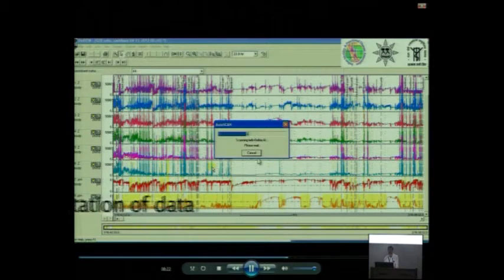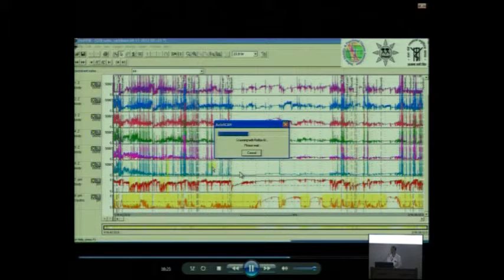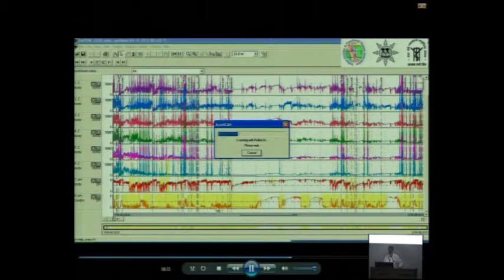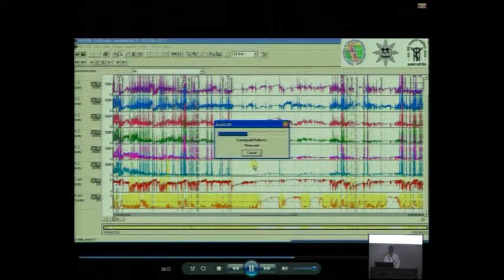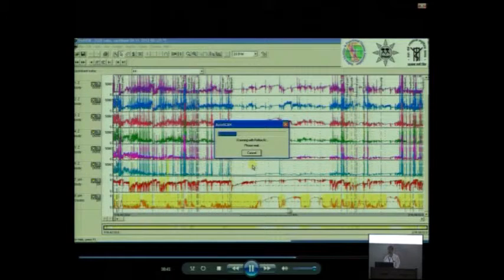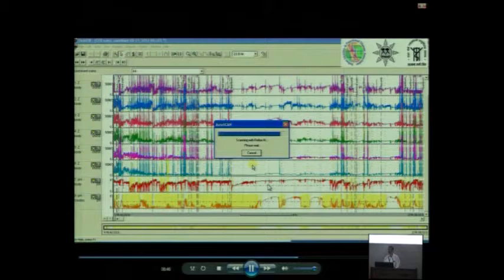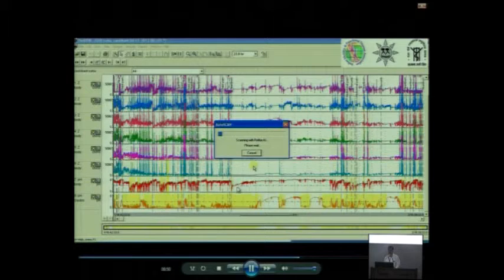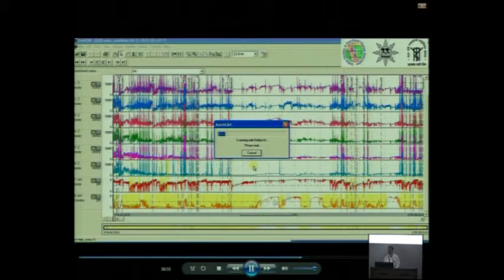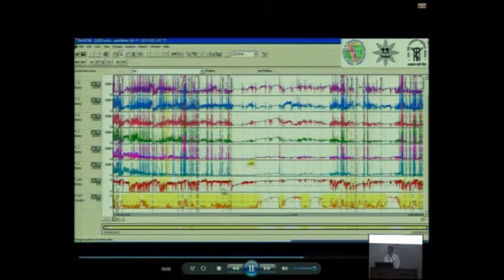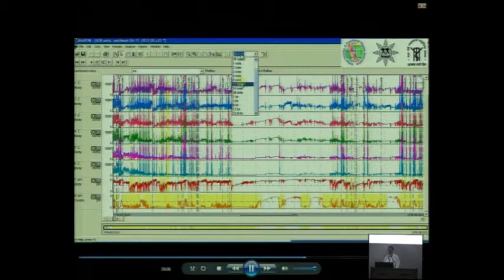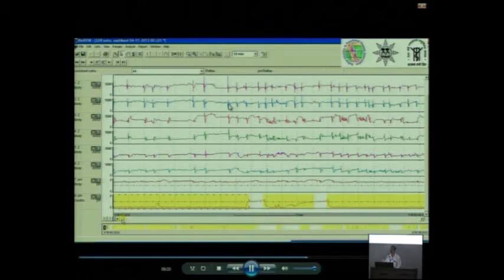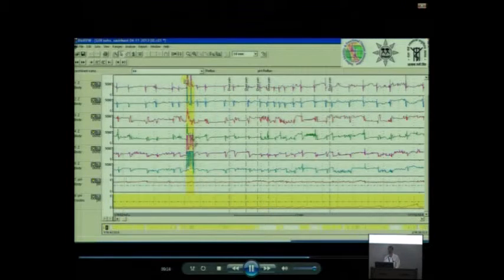Now we'll go to the auto scan. In the auto scan mode, you see the whole of the record. Typically this is the gastric pH, this is the esophageal pH. The lower two tracings are pH tracings, and all these tracings are impedance tracings. If you see there is a dotted line. This dotted line is for pH4. Why pH4? Because pepsin works best below pH4. That's why they have put it at pH4 as the cutoff. Now you see, look at the gastric pH - much of the time it is below pH4. Look at the esophageal pH - much of the time it is above pH4, but there are drops in between and these are reflux episodes. This is a total 23.9 hour record. When you want to scan, what you do is make it 10 minutes and scan one by one.